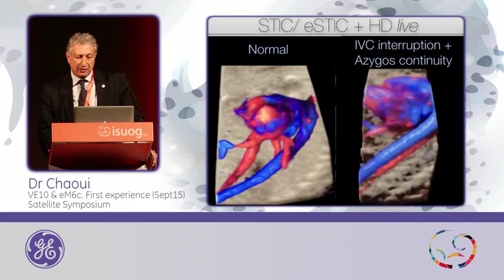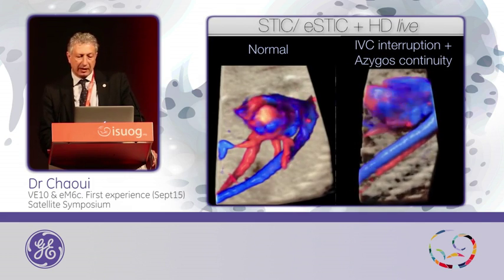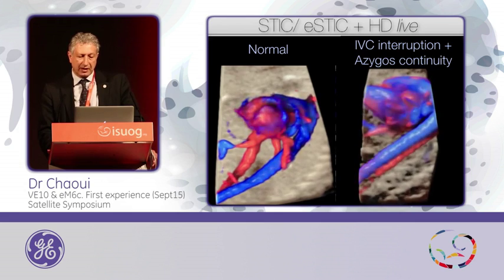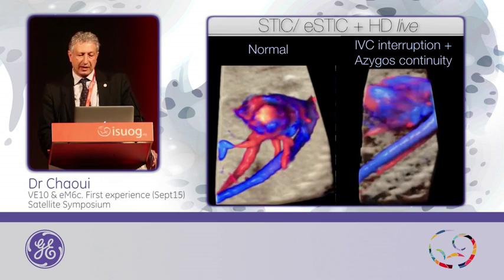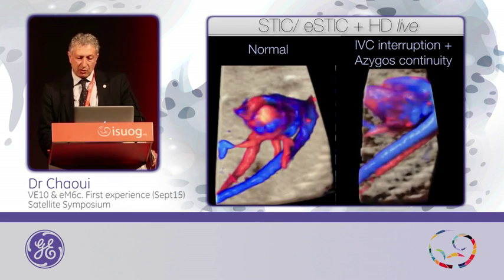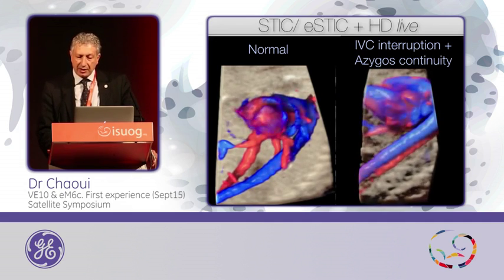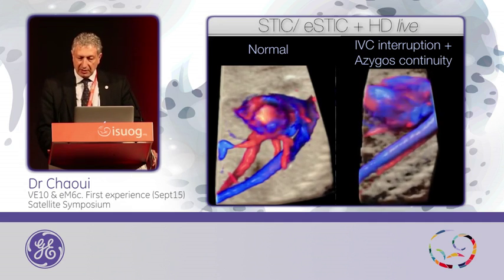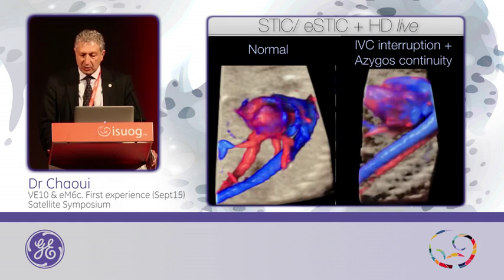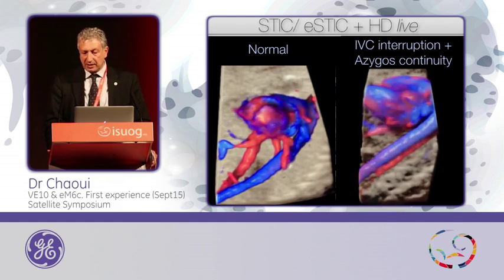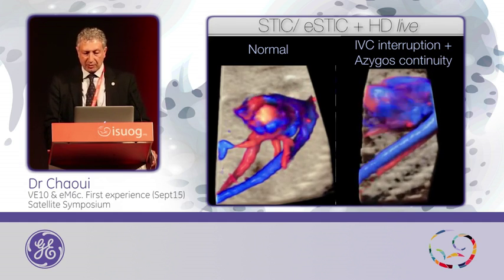And last but not least for this clinical example, getting a view from the left side, you see the IVC — the inferior vena cava — the two pulmonary veins, the descending aorta. In this case there is no inferior vena cava, but you see here behind the aorta the azygos continuity having a direction toward the heart, and this is the descending portion toward the body.